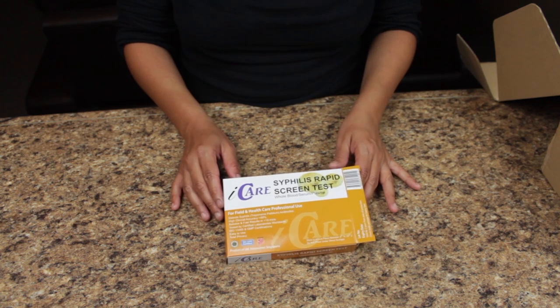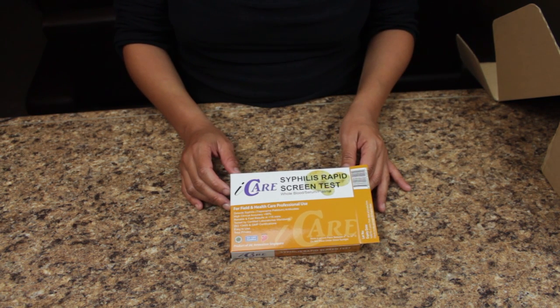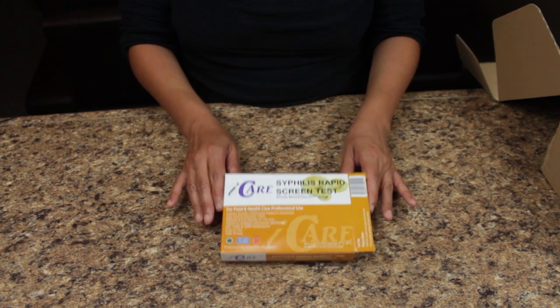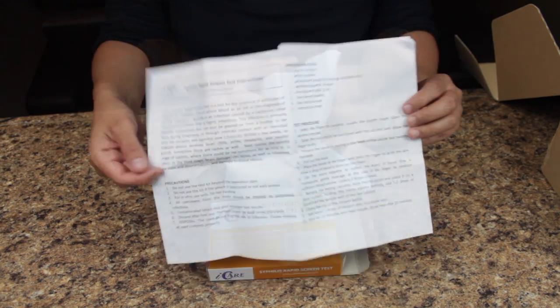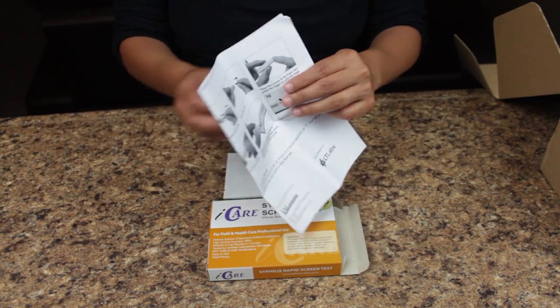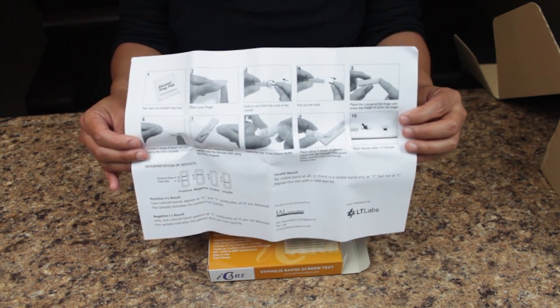This is your iCare Syphilis Rapid Test Screen. Please follow all steps carefully at all times. Opening the package, you will find your instructions insert with detailed instructions as well as easy to follow photos that make it a very simple test to use.